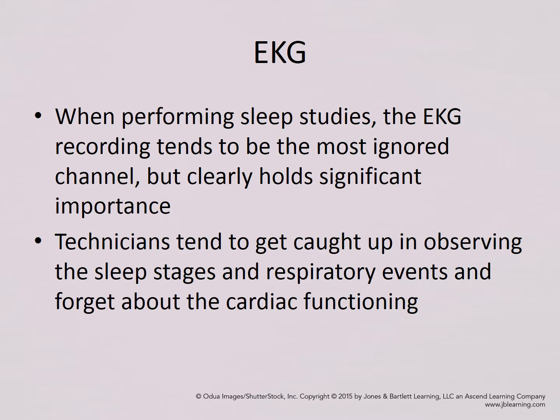When performing sleep studies, the EKG recording tends to be the most ignored channel. Clearly, it does hold significant importance because that is the body's pump. It is pumping blood to all the organs. Technicians tend to get caught up in observing the sleep stages and respiratory events, and we forget about the cardiac functioning. Realistically, you have to keep in mind, our job is to gather accurate and reliable data.